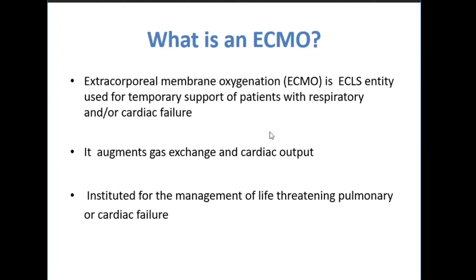Now, let us start with what is ECMO. This is extracorporeal membrane oxygenation, or ECMO, which is a type of extracorporeal life support. Extracorporeal life support, we say, is when we have a system which is outside the native circulation and which is supporting the heart and lung.